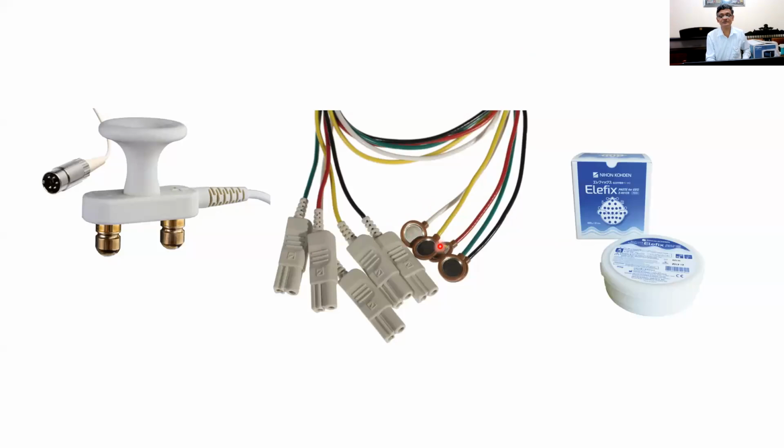And in addition to these 2, the recording electrode and the stimulating electrode, you put a grounding wire, some strap-like thing, to earth the patient, ground the patient, so that additional disturbances will not be there, right? That is not shown. It's usually a Velcro thing. That's the earth for the grounding wire, right?